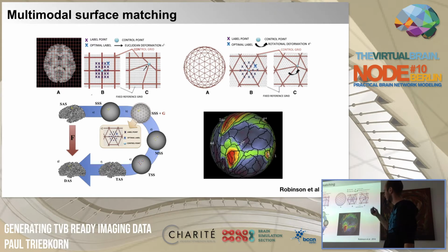This was then taken as a template. Many subjects were averaged on this or registered to this, and finally they also constructed a classifier, which to my knowledge hasn't been released yet. This classifier takes the different modalities and tells you where the different areas are in a particular subject. So this is one technique: you give all these modalities into this classifier, which tells you the location of the different brain areas.